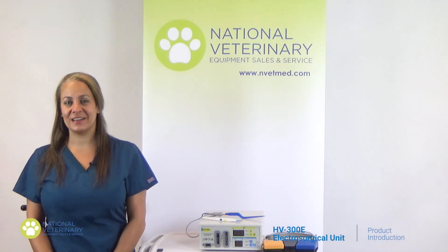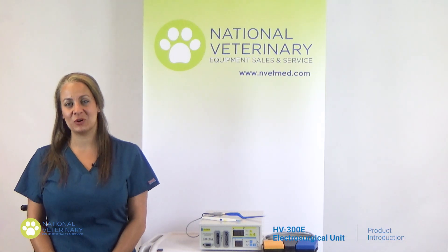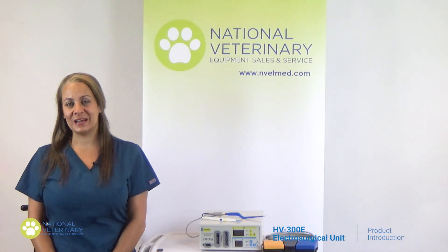Hello, my name is Ashley and I've been a surgical vet tech for more than 25 years. Today I'm doing a quick introduction on our standard cautery unit.